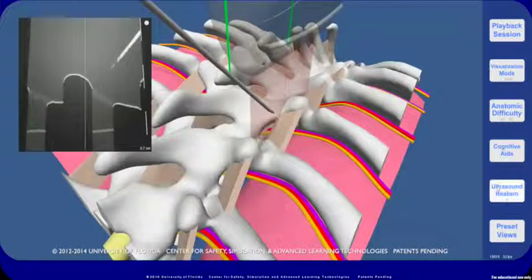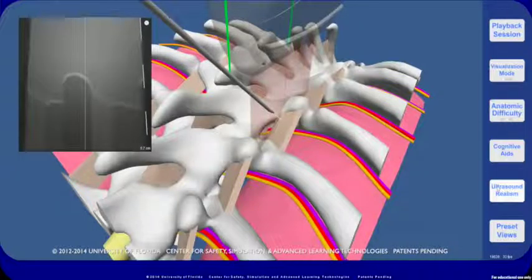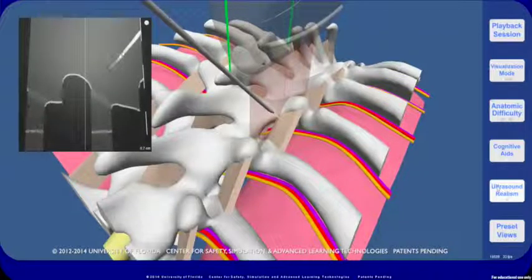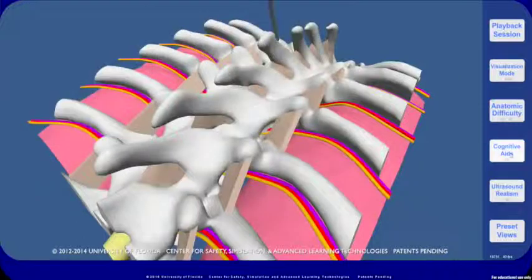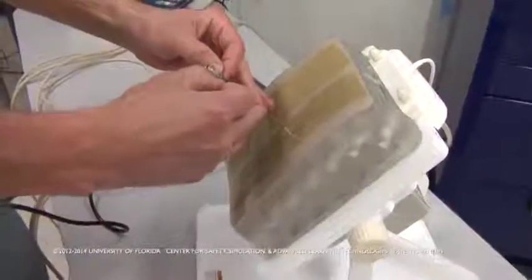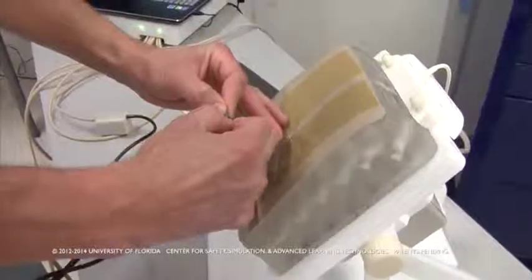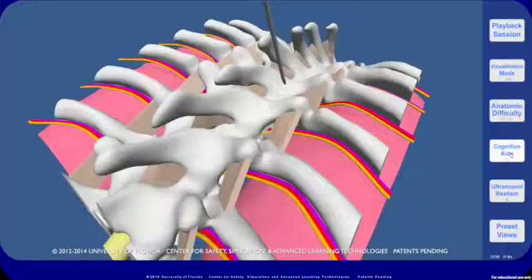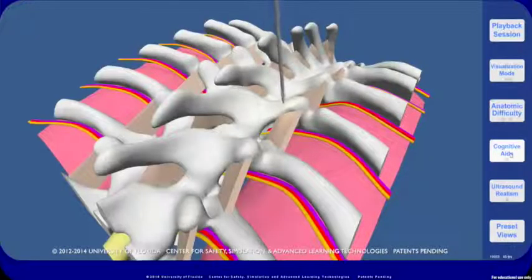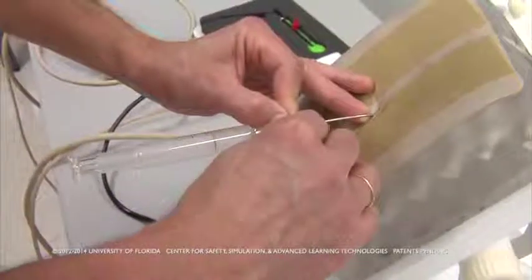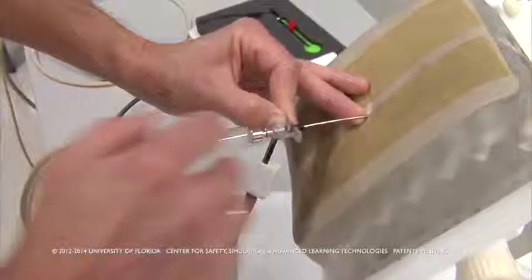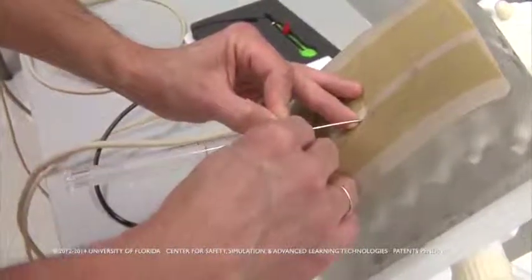Anisotropy and depth attenuation of the ultrasound image can be toggled with the ultrasound realism button. The needle is tracked within the virtual model. While contact with physical bone is made with the real needle, a tactile feedback system provides the feeling of perforating virtual ligaments, whereby the syringe plunger moves when the needle tip is in the proper subligament space.